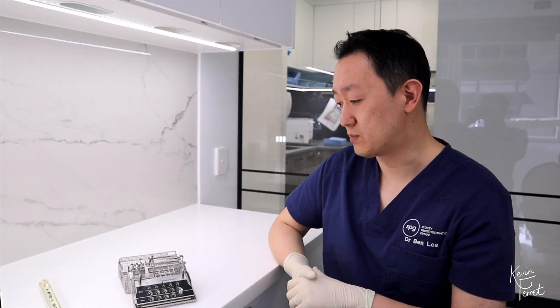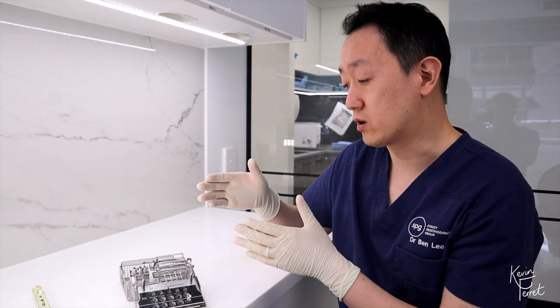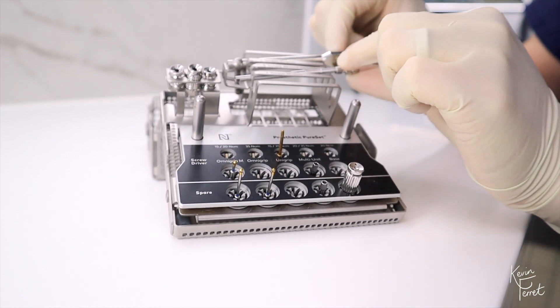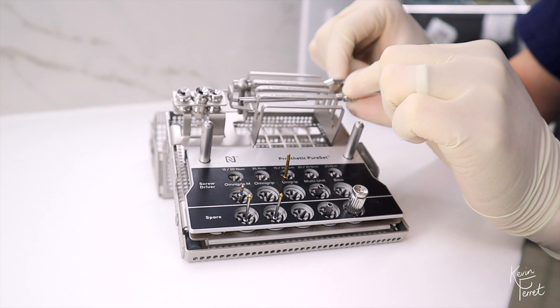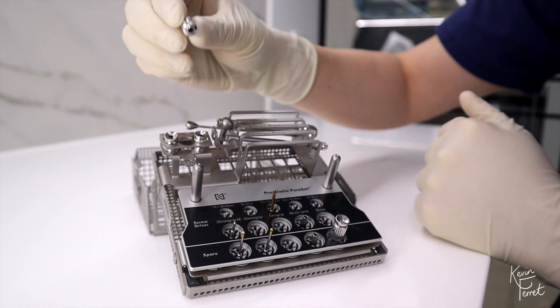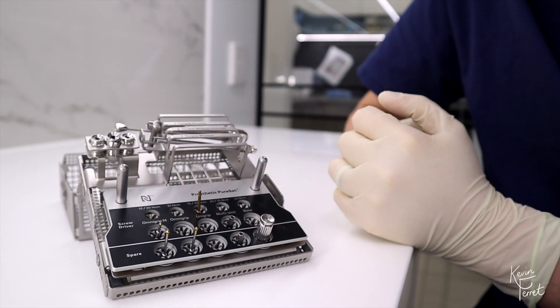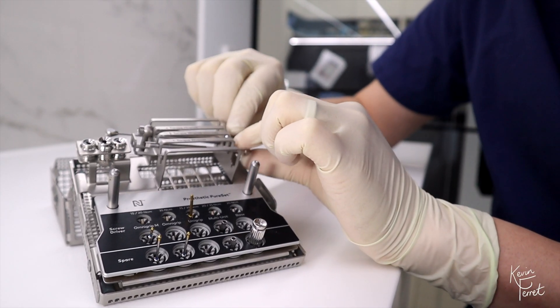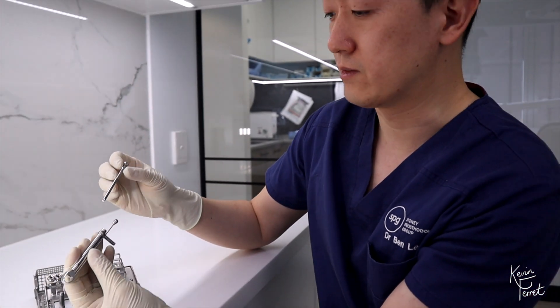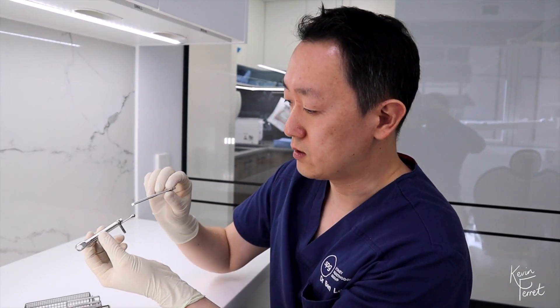Let's take a look at the Noble BioCare PureSet Prosthetic Kit. I'll give you a quick overview and then go in-depth on each of the different components. One of the most important parts is the torque wrench, which comes in two different pieces. You'll also have a manual adapter and a torque wrench adapter. The torque wrench itself has two pieces: the actual torque wrench and the spring bar.